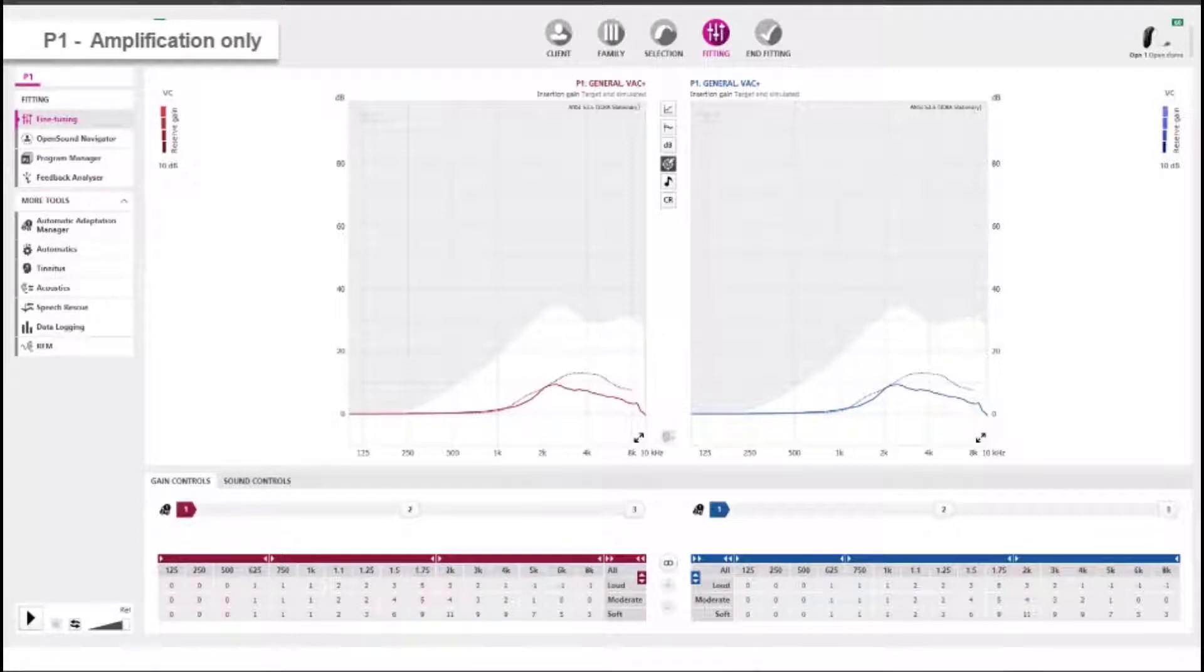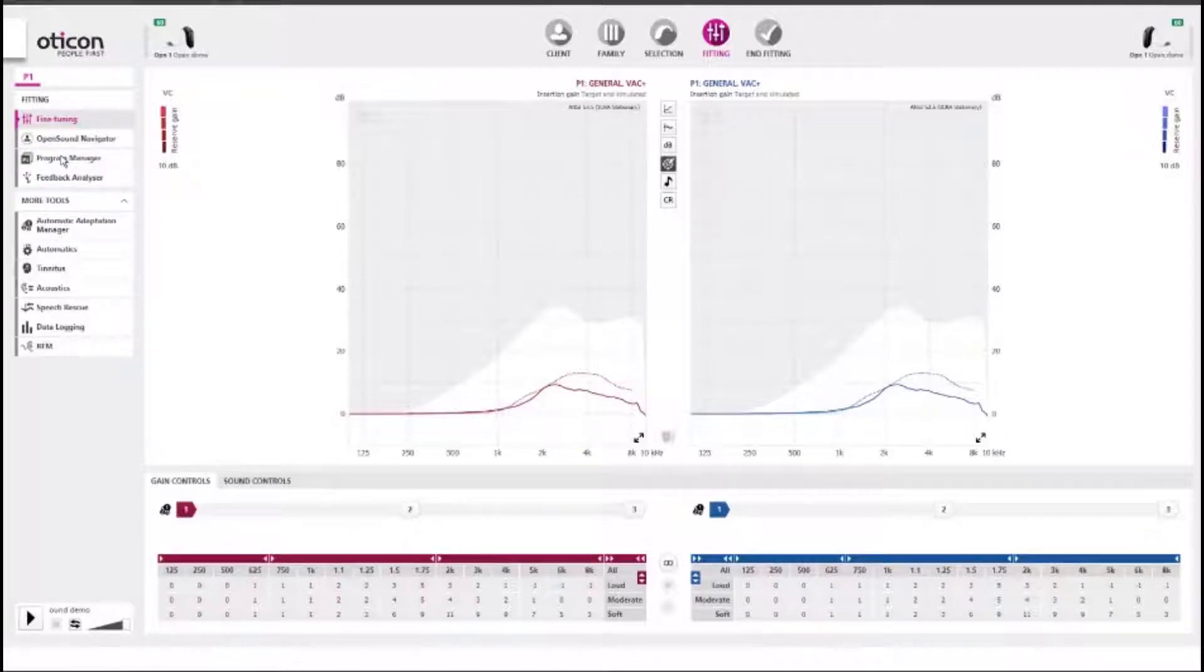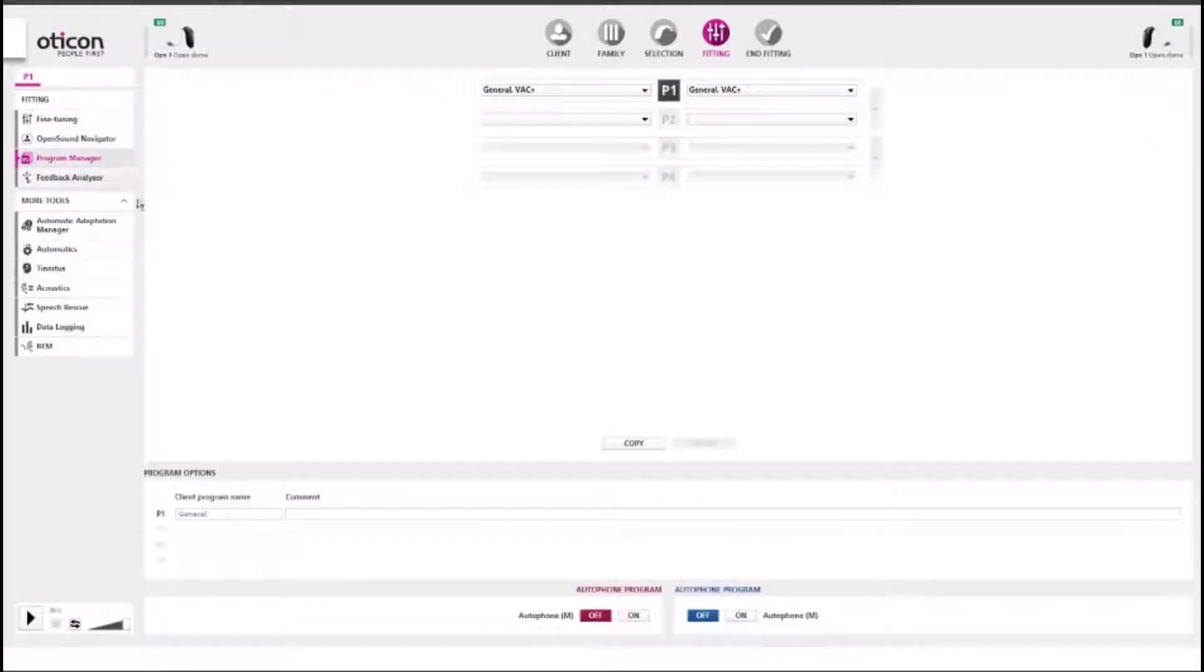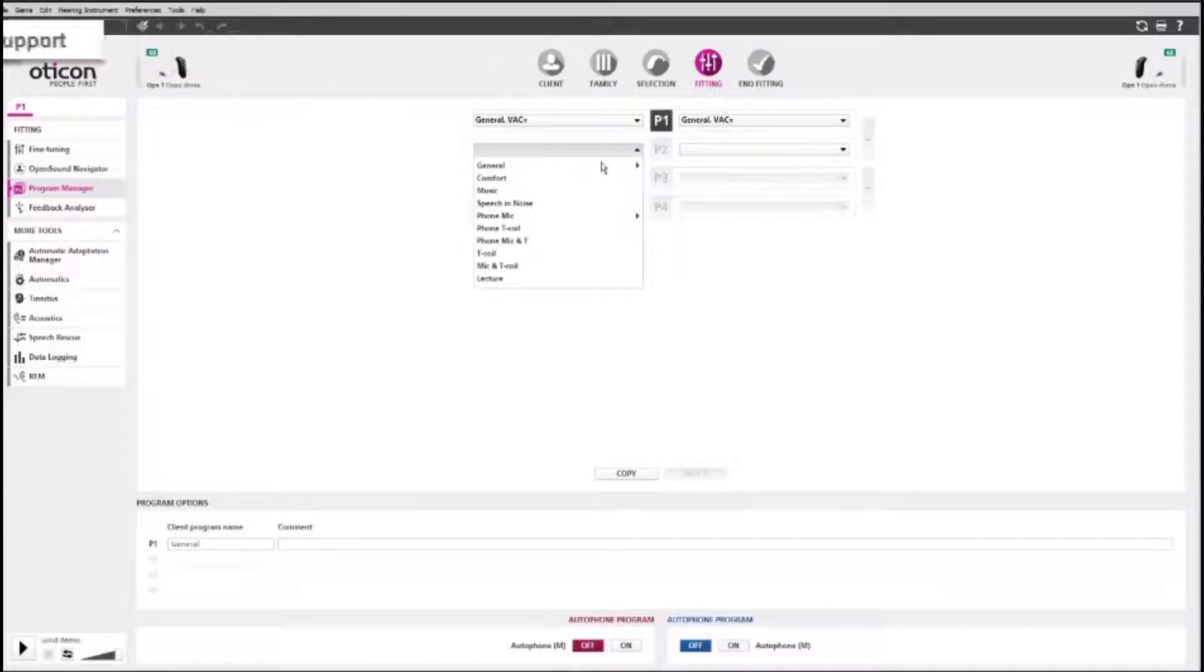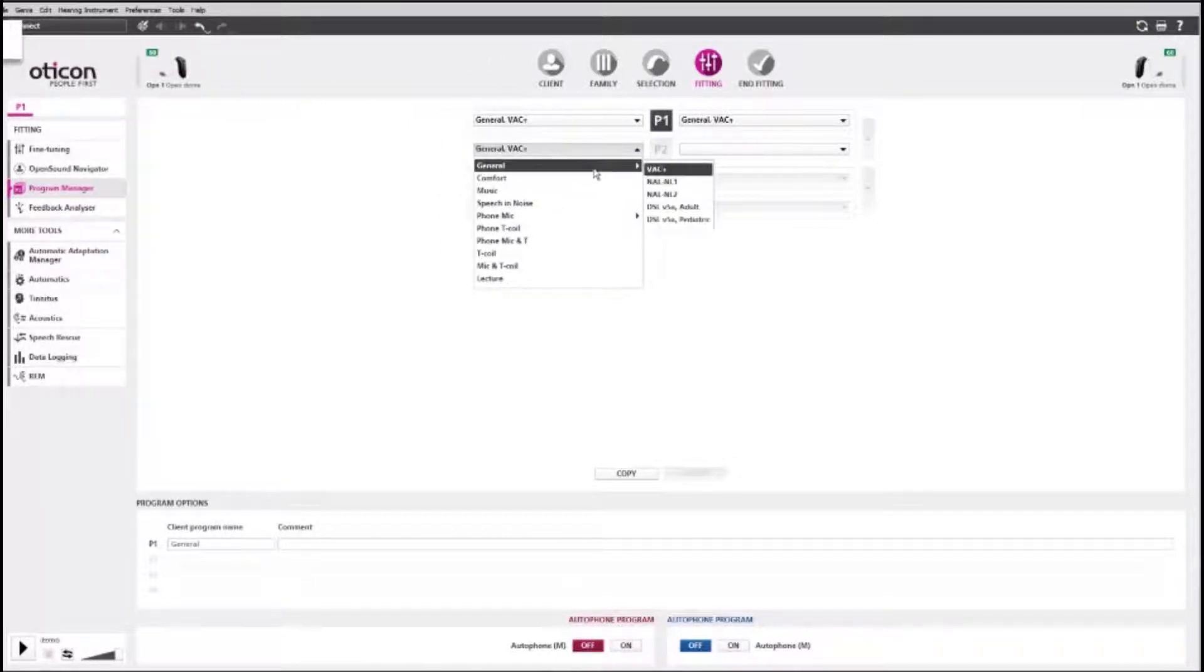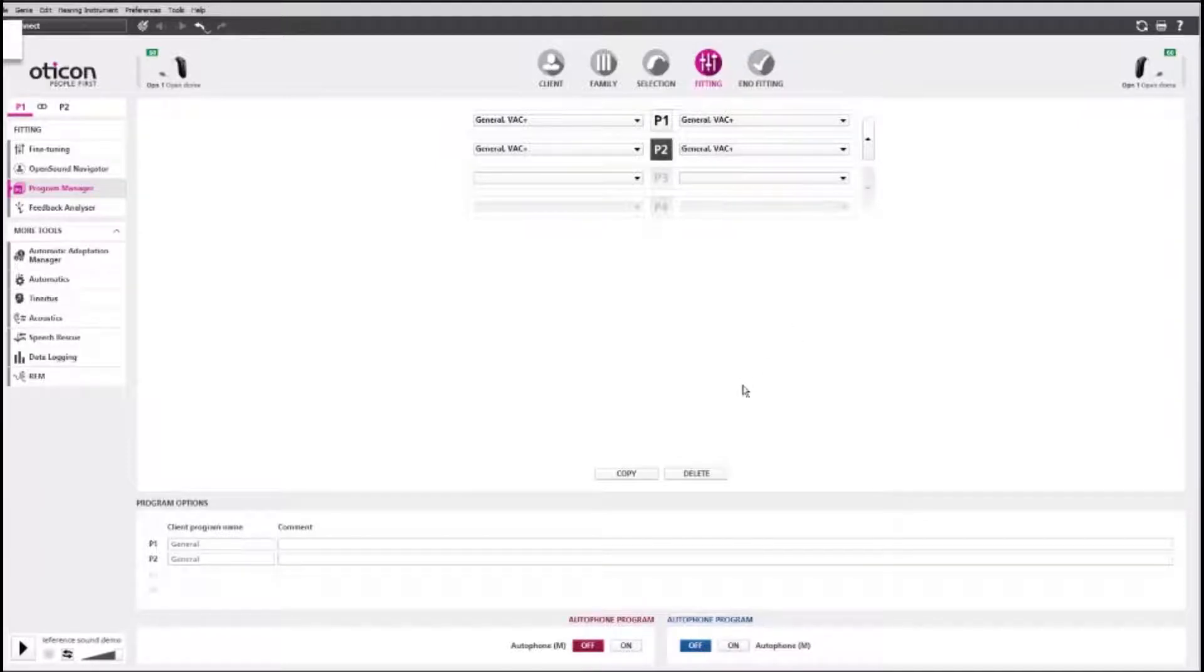Many clients with tinnitus will find relief in amplification alone. To accommodate this, set P1 for amplification only. Tinnitus Sound Support can be implemented in any of the four programs. Create a second program in P2 and go to the Tinnitus tool.